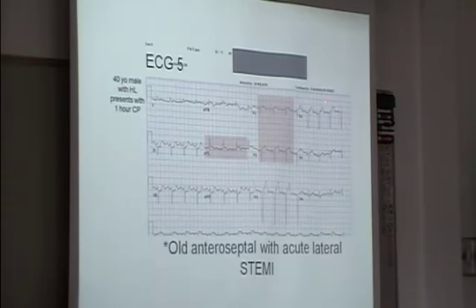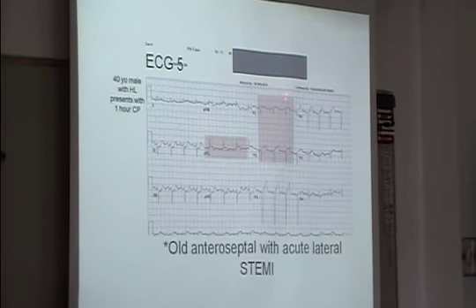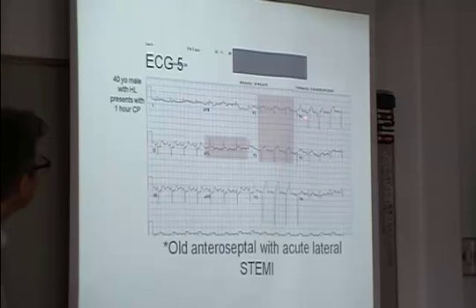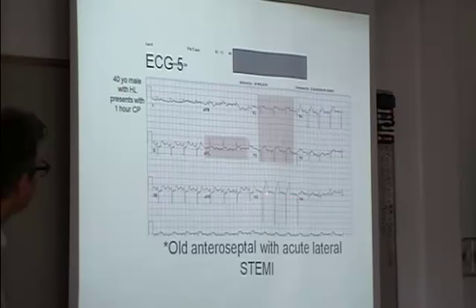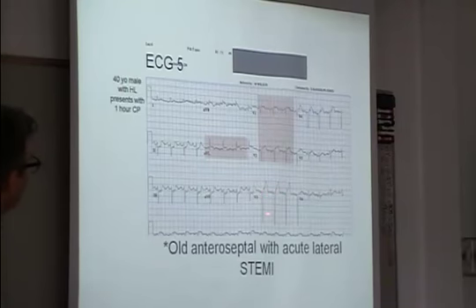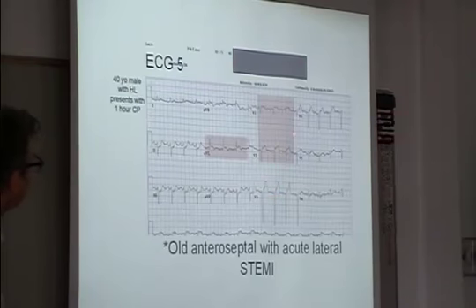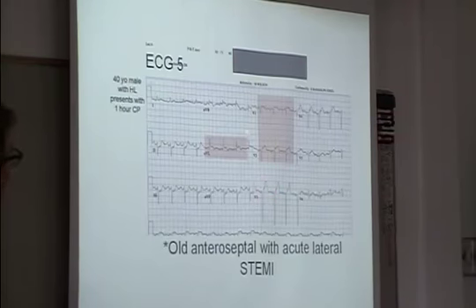I didn't point out everything, but I was trying to point out this correlation between the high lateral and the septal area. You could argue that V4 has ST elevation too, and V3 as well. You could argue this whole area. And also you see that there's no R waves, which is a kind of clue to an old infarct.